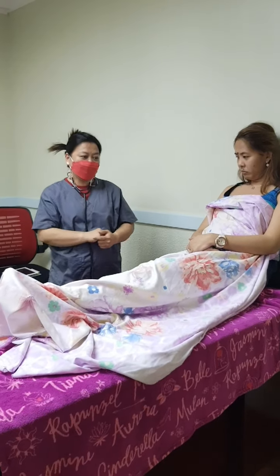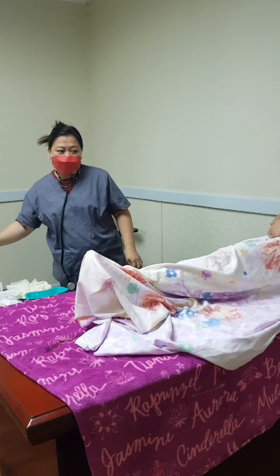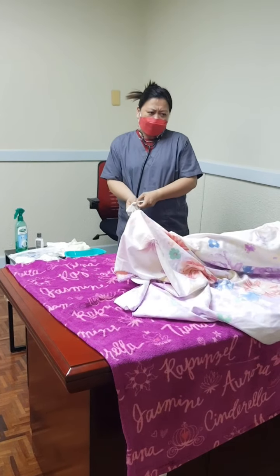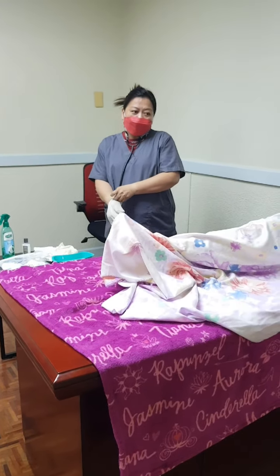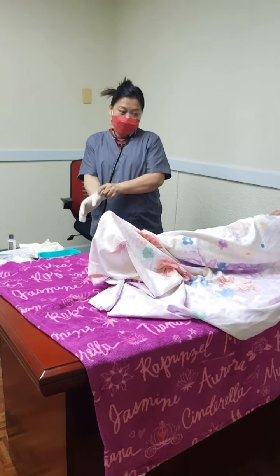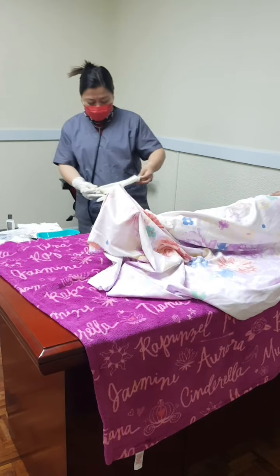Perform hand hygiene. Wear disposable gloves if available. Hand hygiene deters the spread of microorganisms. Sterile technique is not required because the digestive tract is not sterile. Gloves protect from exposure to blood or body fluids.